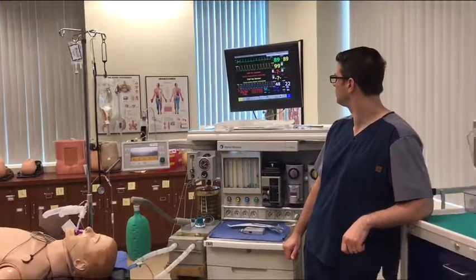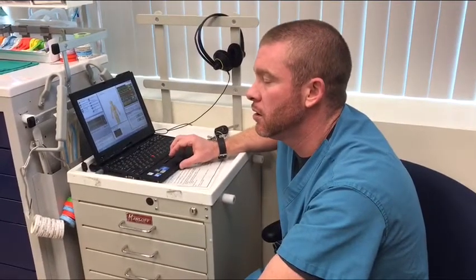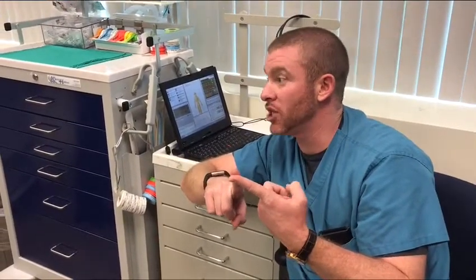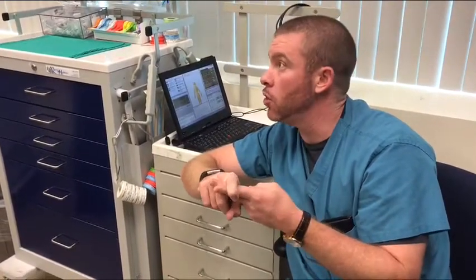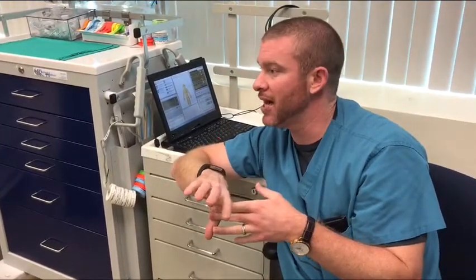At this point is where you're going to start talking to your patients. I would suction the oropharynx again. And then what I'm looking for here is, let's go through this. I went through 4 out of 4 with sustained tetany. I have no gas or 0.1 of gas on board. He's fully reversed. We just established that.